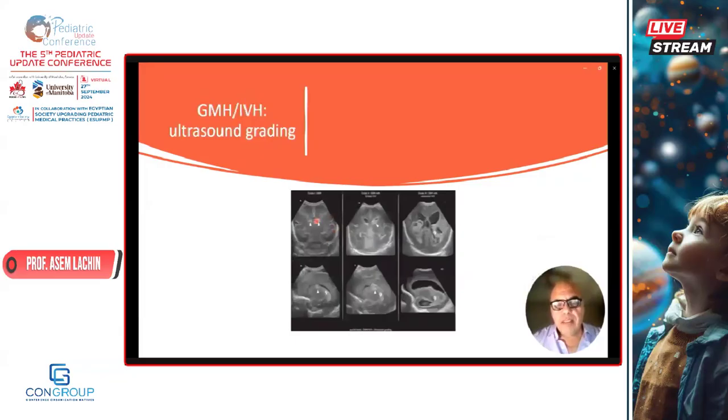This again shows some grading of IVH, starting with germinal matrix IVH in those areas and increased in the anterior horn of the lateral ventricle, and here there is some dilatation of the lateral ventricle. And this is a coronal section, and this is the sagittal section we can see here.